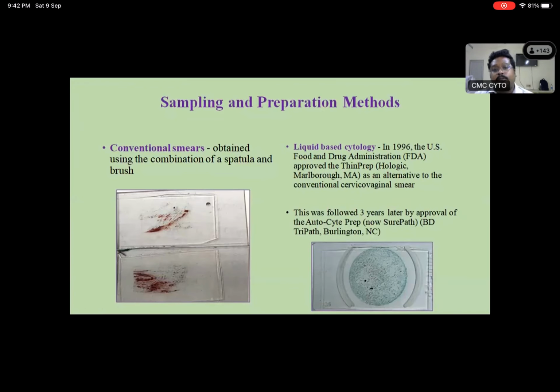So before that, Dr. Sweetie, what type of preparation have you seen before, conventional or LBC?